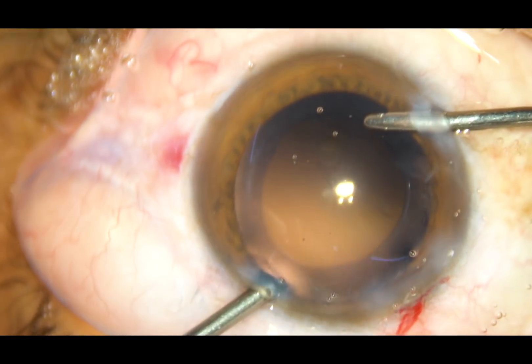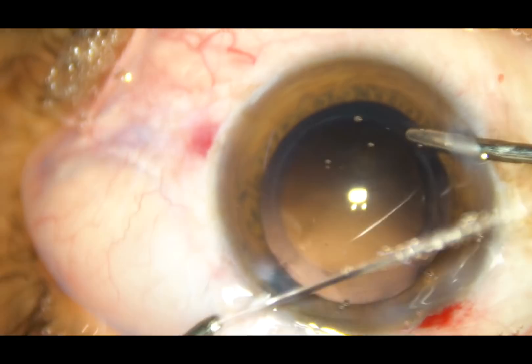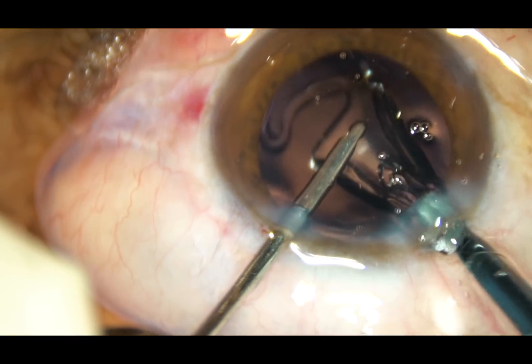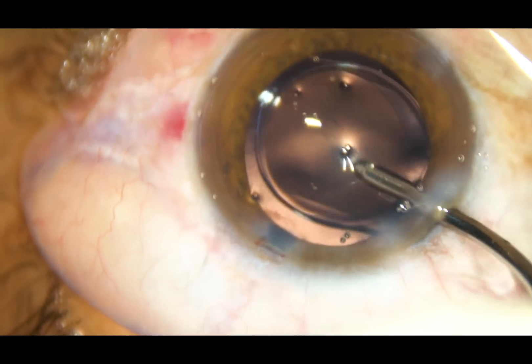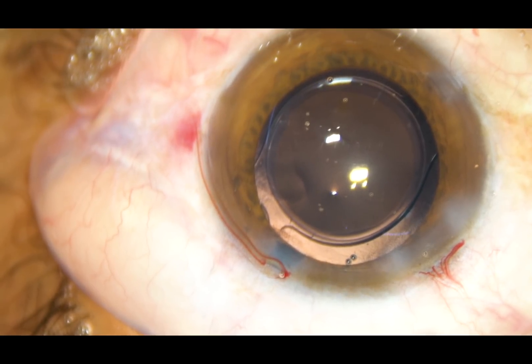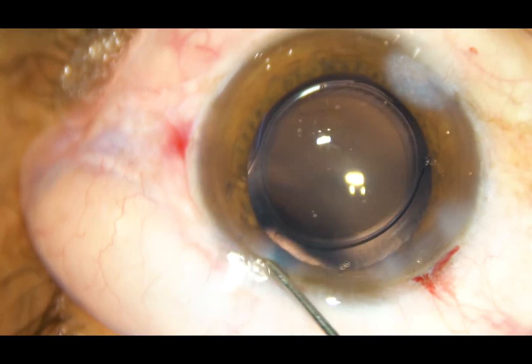Now the probes are changed — aspiration is through the left side port and irrigation is through the right side port, and the cortical matter is removed. After thorough removal of the cortex, a foldable intraocular lens is being implanted in the capsular bag. The irrigating probe can place the lens in the bag since a hook is usually not required. We can see that the right optic of the intraocular lens is nicely overlapped by the anterior capsular rim, which means the rhexis size is ideal.